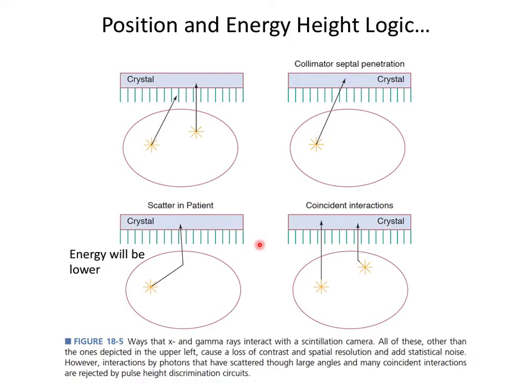And then there's another interesting problem, which is if the photon interacts with an atom inside the patient, which causes a scattering of the photon, so it leaves some energy behind and scatters off this point towards the detector and causes an event here, then you've incorrectly encoded that thing to a line down here versus over here.